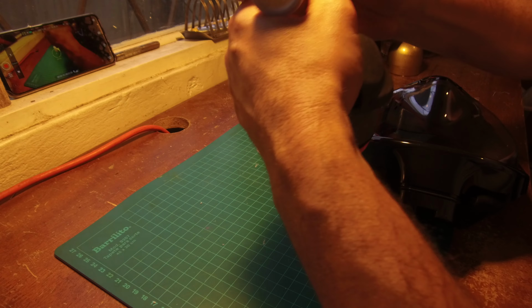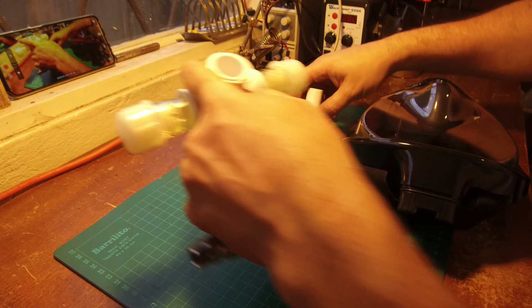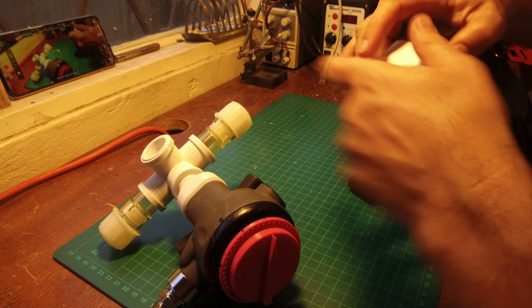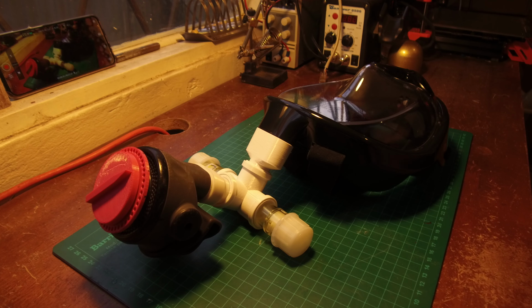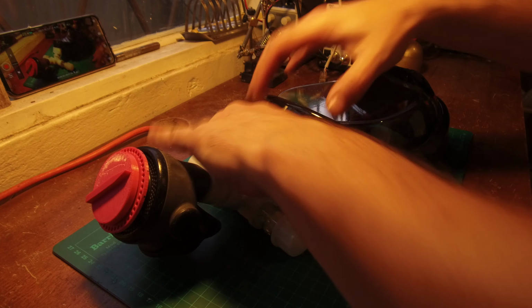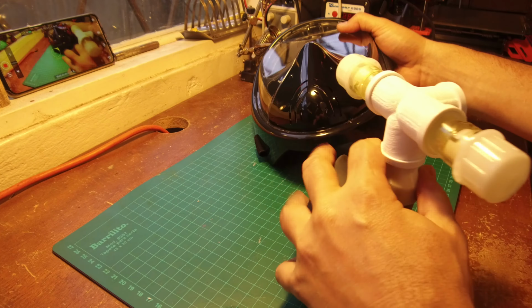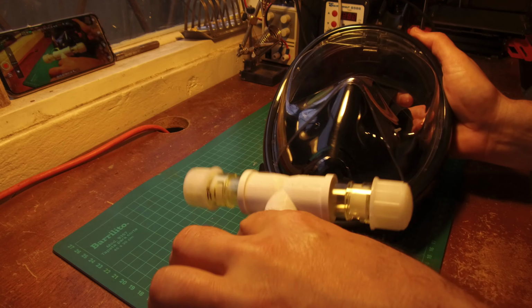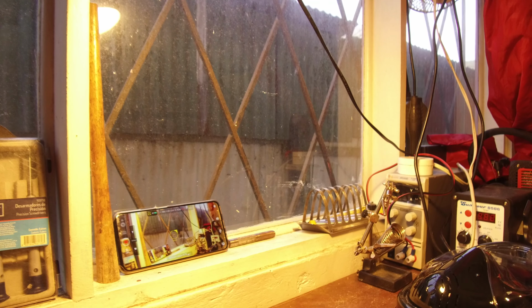Basically, it's the same thing, but it's a little bit smaller and neater, right? This goes here. If you want the files, send me a private message. I'll send you the file so you can print it yourself. It's smaller, it's more comfortable. I also have an add-on. If you have this, it goes on the front part of the mask. Of course, you can glue everything together for more resistance. This is an open source project.